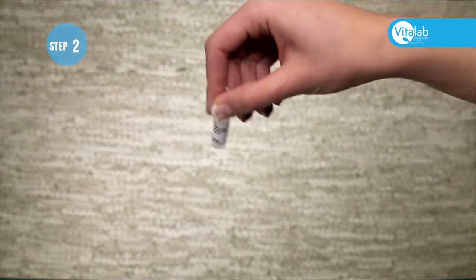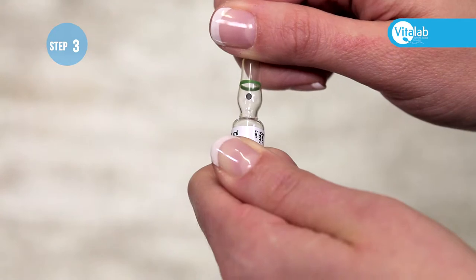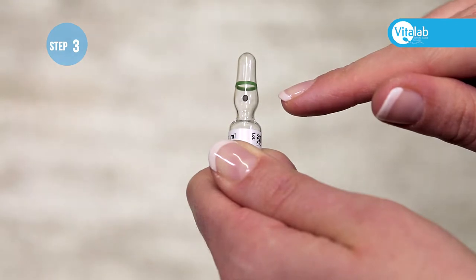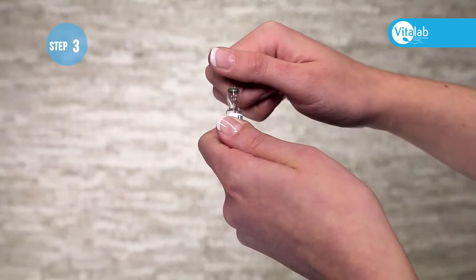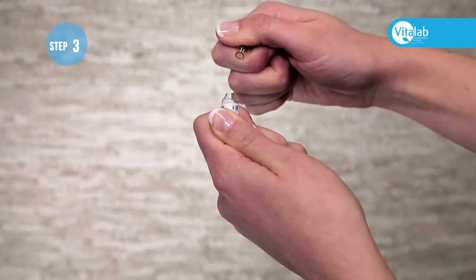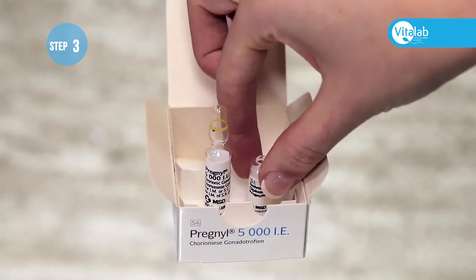Open the water ampoule by holding it by the top and swirling it around so all the water goes into the bottom of the ampoule. Face the blue dot on the ampoule upwards towards the ceiling. If you are right-handed, hold the bottom half of the ampoule in your left hand and the top part in your right hand. Snap the top downwards away from the blue dot. Discard the top part into the sharps container and place the ampoule on a flat surface.